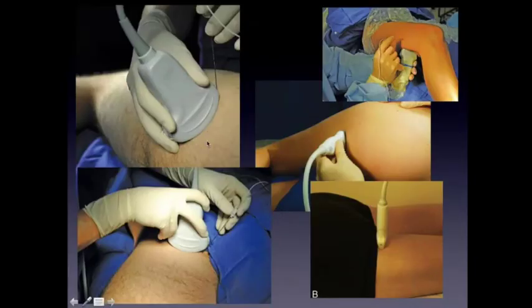Here we can see the many approaches that we have for the sciatic nerve block. We have the deeper ones, the posterior, the gluteal, let's say a posterior approach. Here we have the anterior one. You see that we use here long needles, like 10 centimeter needles, and curved transducers. Here we have some more superficial approaches like lateral popliteal, subgluteal, infragluteal.